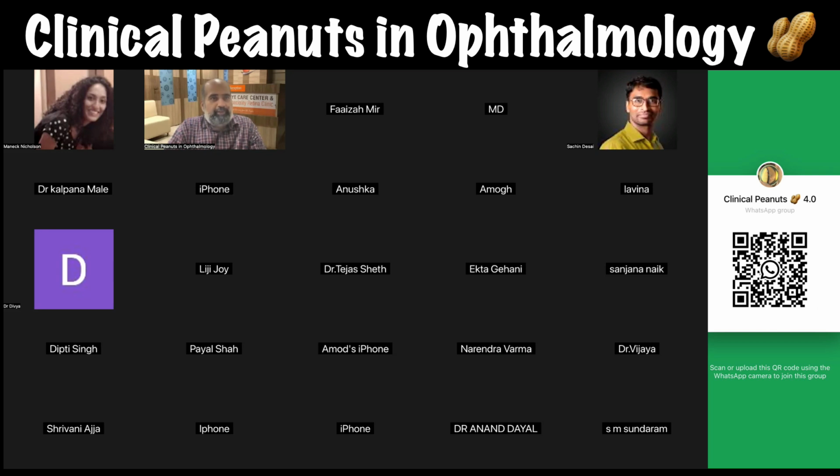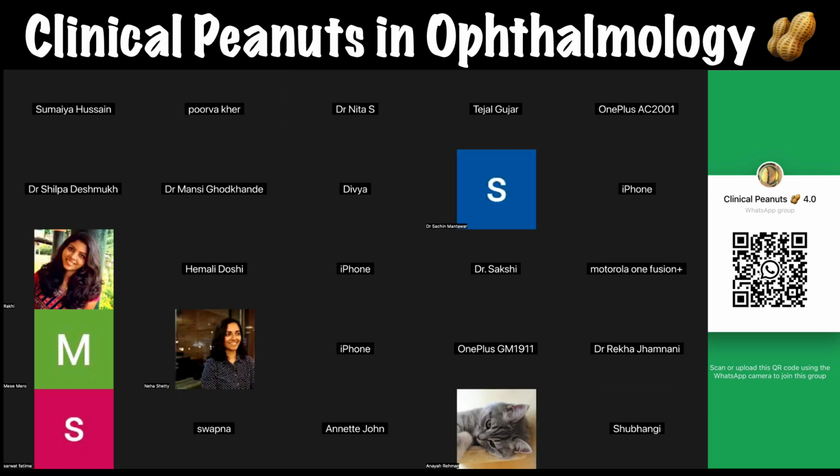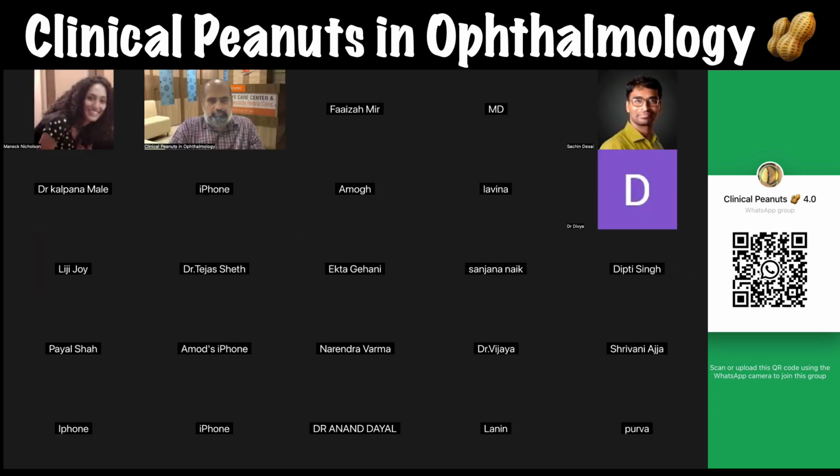So do you feel that one should calculate their surgically induced astigmatism before? Honestly, I think it's great if you can. What I have seen most senior surgeons do is take around 0.2 to 0.3 diopters of error for their temporal incisions, which most of them sit on, and that is for a 2.8 millimeter incision made at the limbus.